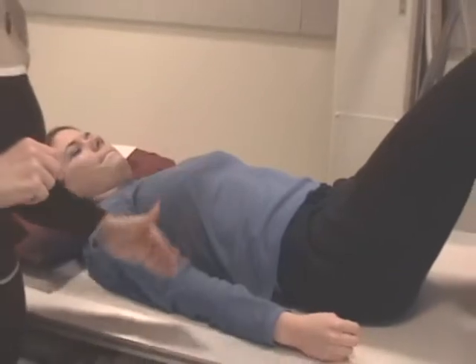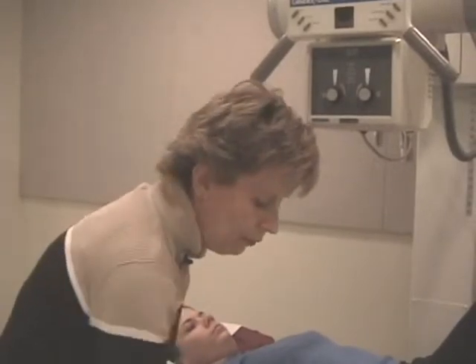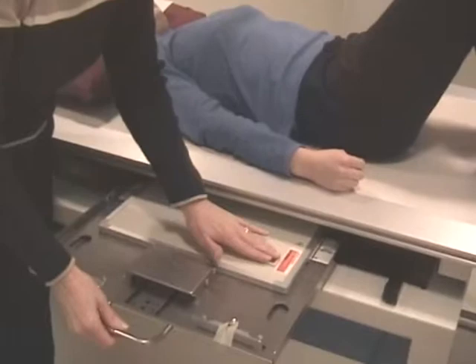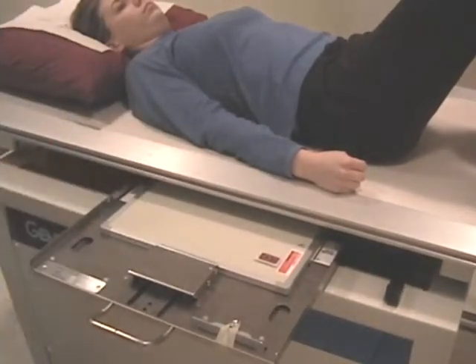I'm going to demonstrate the RPO because I think we'll have a better camera angle that way. With an RPO, I'm going to use a right marker. I'm going to move the marker in a ways because I have collimated in here. I'm going to let you take a look at that marker.